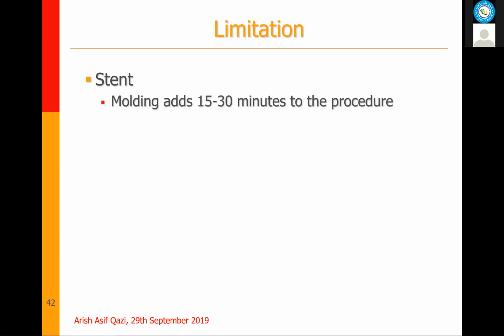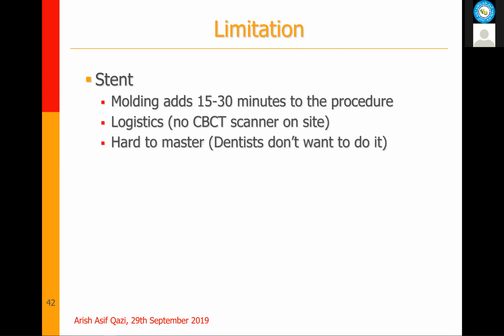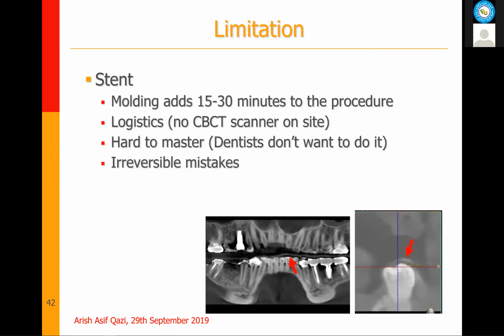So the molding, although in the video it's not very apparent, actually adds 15 to 30 minutes to the procedure time. And many dentists don't have a CT scanner on site, so they have to send the patient to a hospital. And making the stent is not easy. The dentists don't want to do it, and when the assistants do it, they actually mess things up.